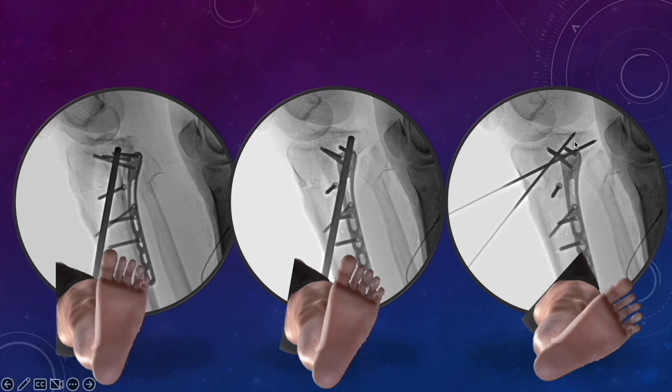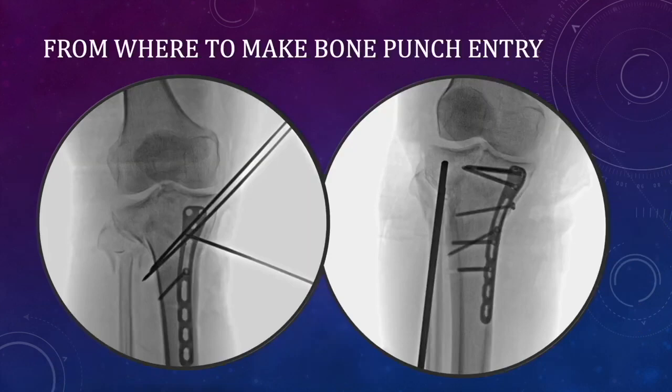So we have lifted it further and then secured it with multiple K-wires from the medial condyle to the lateral condyle posterior part. If we rotate the tibia more externally, we will be able to visualize the posterior half of the lateral condyle in a better manner. So you see, you are able to see the medial condyle here and the posterior part of the lateral condyle. These two views are definitely useful whenever you are elevating the depressed fragments. So by now we are able to solve the problem of localizing the fragments in the preoperative period as well as intraoperative period.